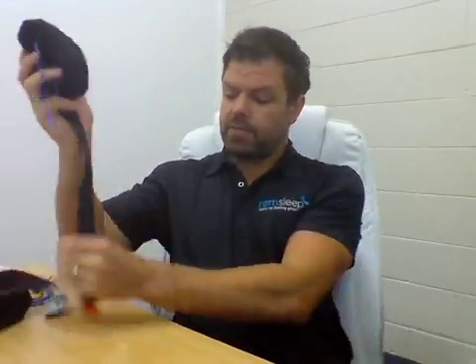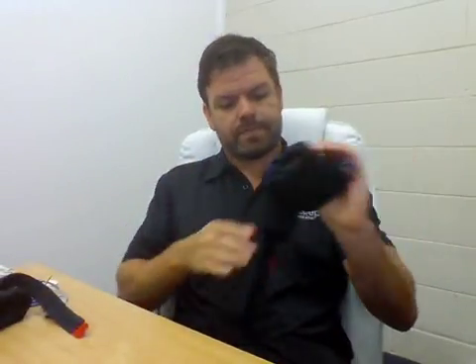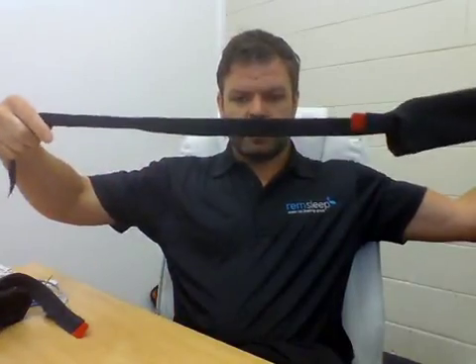So the first part we're going to do with the instructions is step 1, and this is putting on the respiratory bands. So if you get all your equipment out and put it on a table, you can follow along with this, and that way if you need to, you can pause the video at any stage as well. But these are the respiratory bands that we have. Okay, they look like this. It's sort of a thick part and a thin, and you'll have one that has a blue cable and the other one has a yellow cable.